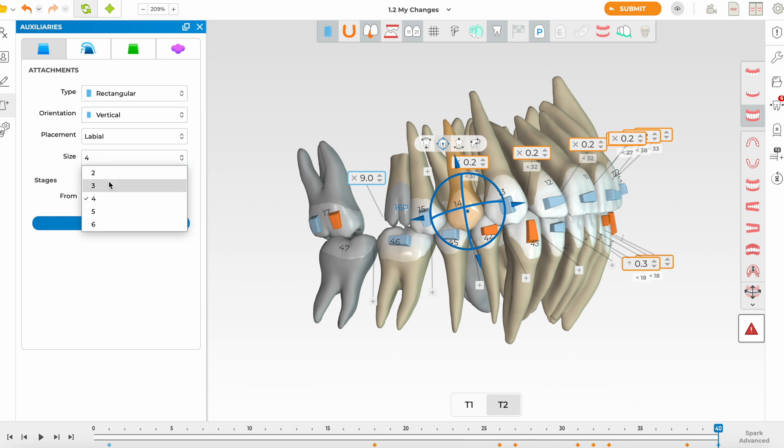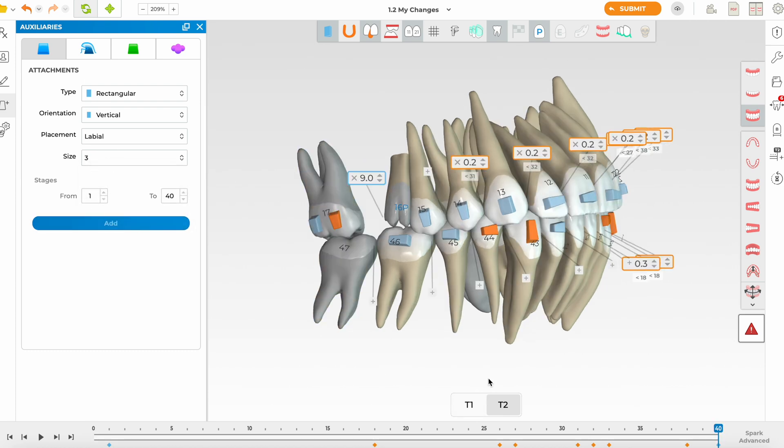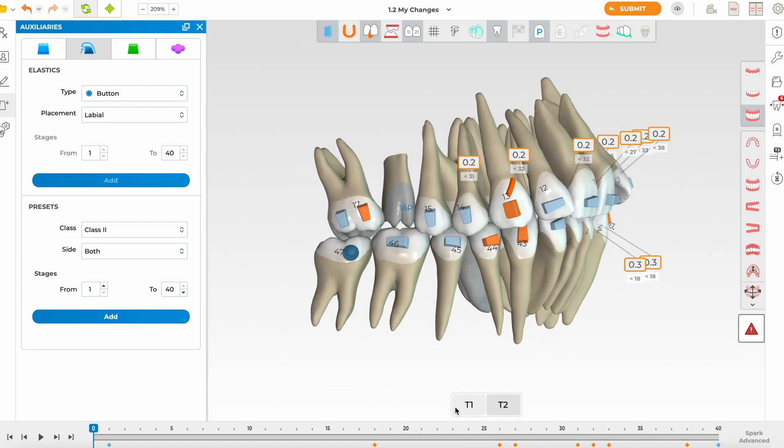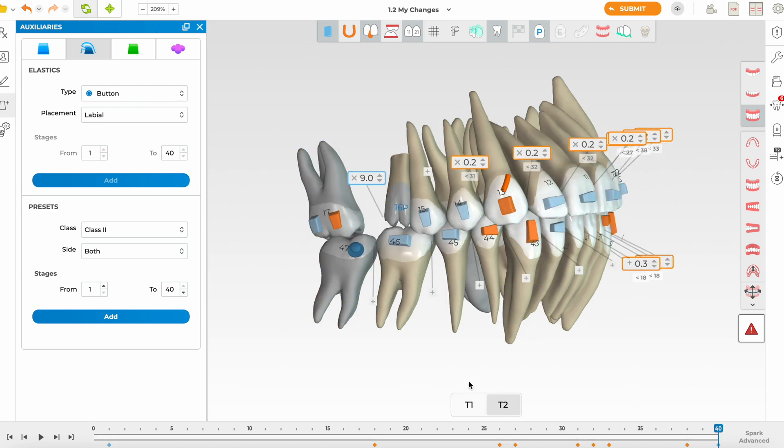In Spark I often place more attachments than I would with Invisalign — the material has a nice flexibility. There's quite a lot of movement here so we'll slow it down. I think it would be beneficial to have class 2 elastics, even just for nighttime wear. I'm going to add a button cutout on tooth 4.7 on the mesial buccal cusp for ease of bonding — nighttime elastic wear will help with that distalization movement.